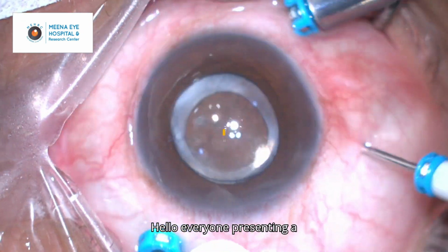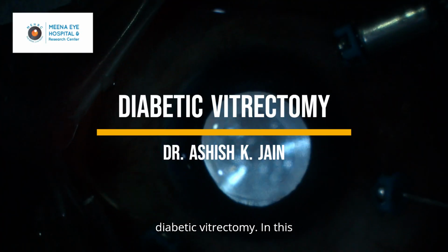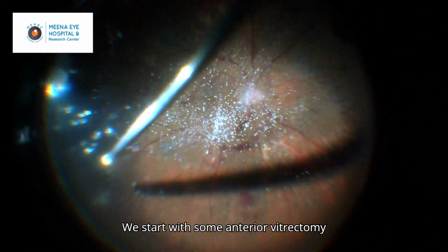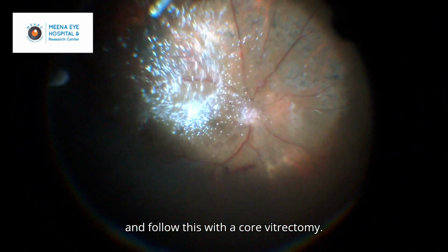Hello everyone, presenting a diabetic vitrectomy. In this pre-op OCT, you can see the foveal traction of the taut hyaloid with an epiretinal membrane. We start with some anterior vitrectomy and follow this with a core vitrectomy.